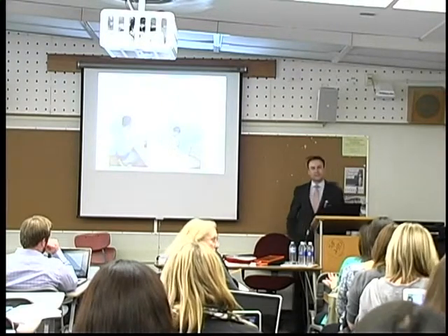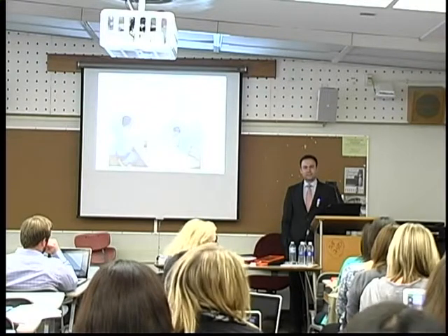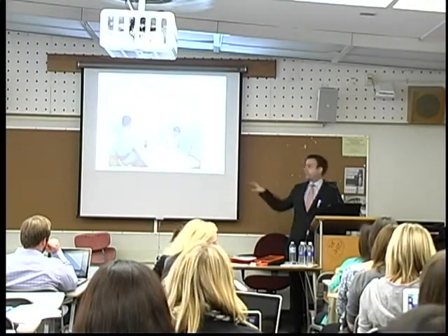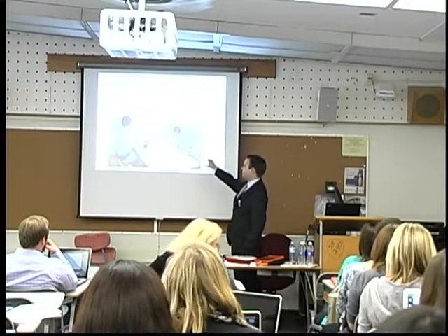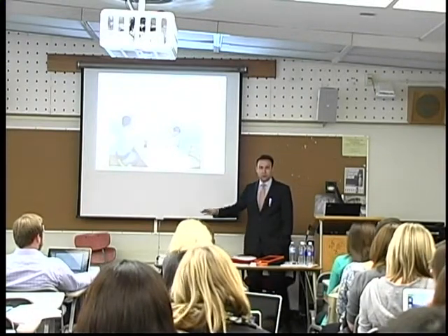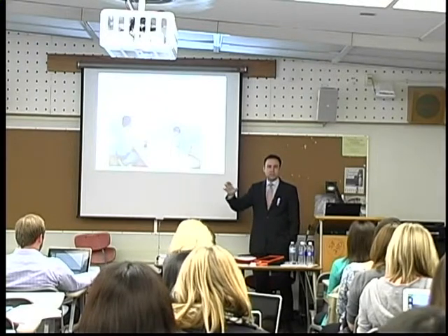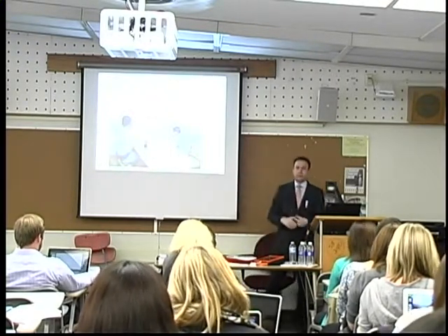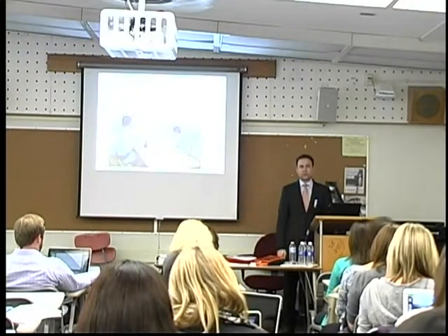This is a real issue, if the kid has mastered this app and we want to switch them to another app, which happens all the time. Oh yeah, no, this is fine. We were composing this as a stepping stone. If the kid is growing, it's perfectly fine. We don't say they should always stick with Speak All. It's perfect if they can then move on to more sophisticated apps that have an on-screen keyboard to teach literacy, for example, or advanced features that we can't provide with our relatively simple app.